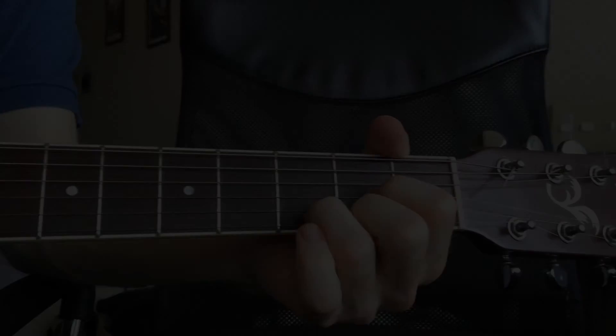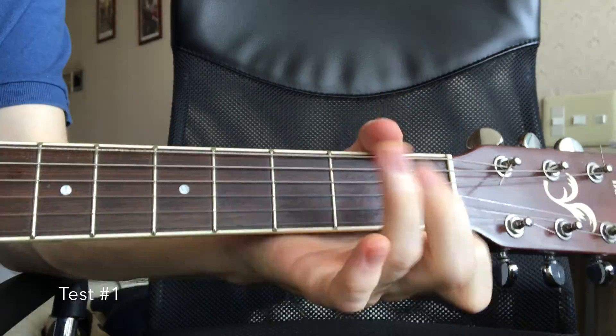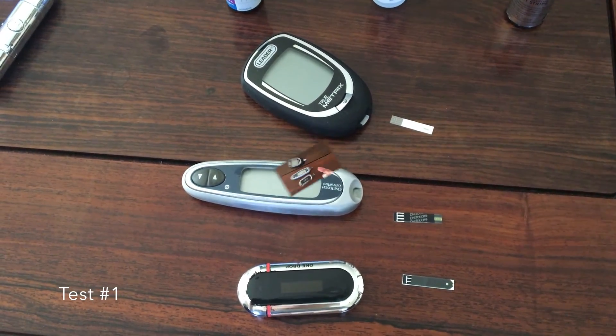In my secret life, I play guitar, which means my left hand is reserved for Arlo Guthrie and Black Sabbath. So all finger bleeding is done with my right hand, which is why these are all upside down.